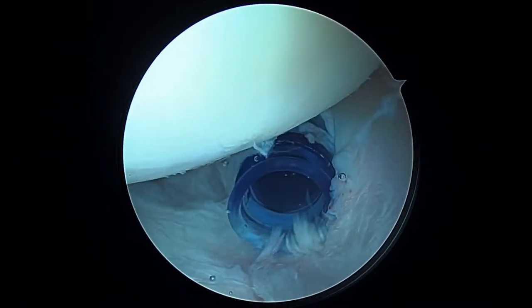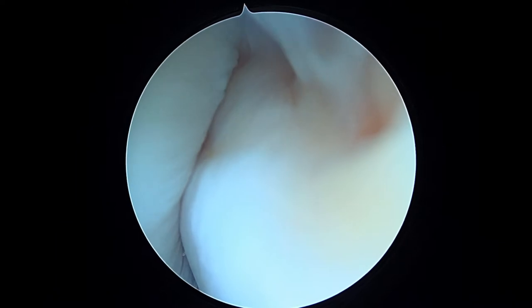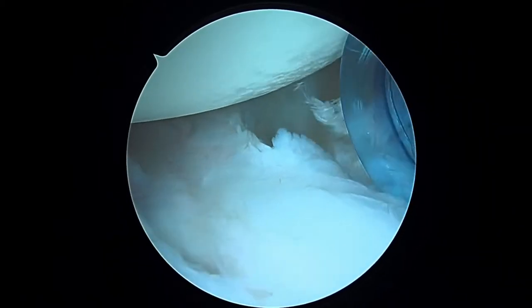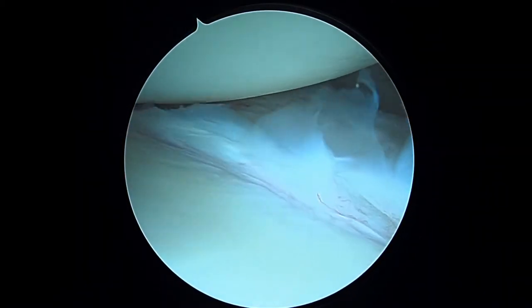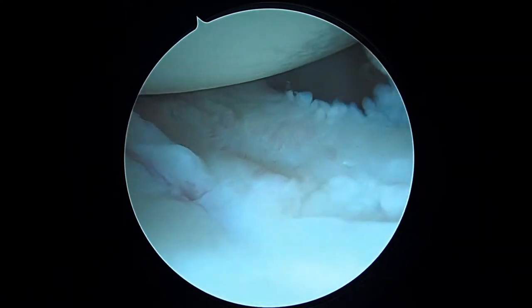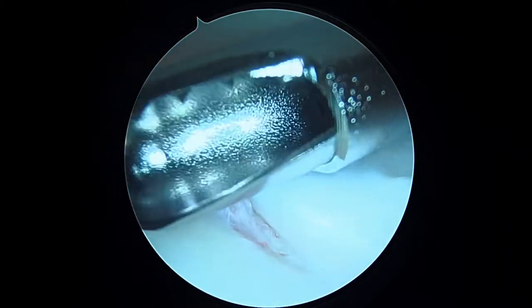Before we do that, we're going to look around the rest of the shoulder. This is the posterior aspect of the joint — this posterior capsule — and that looks good. We'll look down the front of the shoulder and here are the anterior structures. We'll put in the shaver just to make sure. Yeah, these things all look pretty good, so I don't really see much else to worry about here.